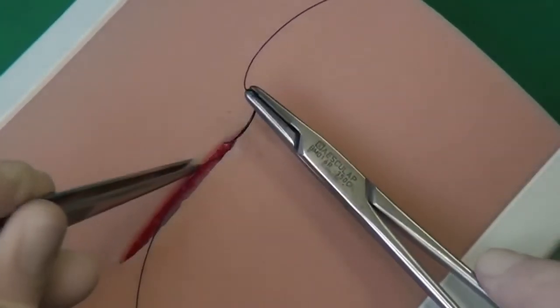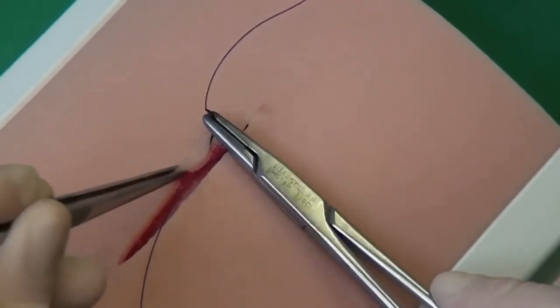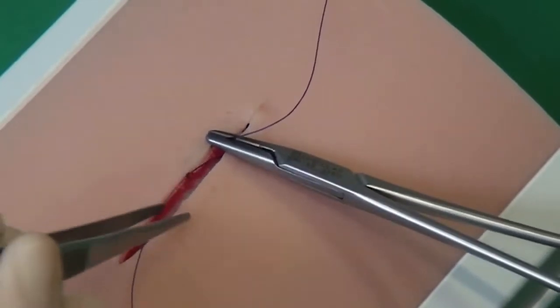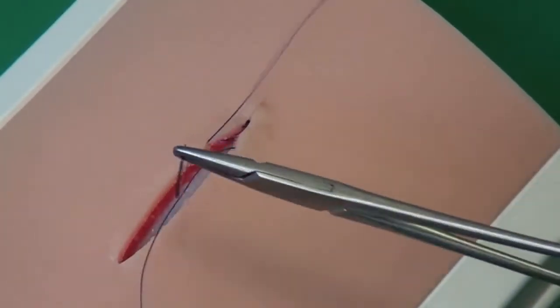The insertion on the opposite side is made approximately at the level of the previous exit point, so that the thread runs slightly diagonally to the wound gap when changing to the other side. Therefore, the overall suture becomes serpentine or meander-shaped.